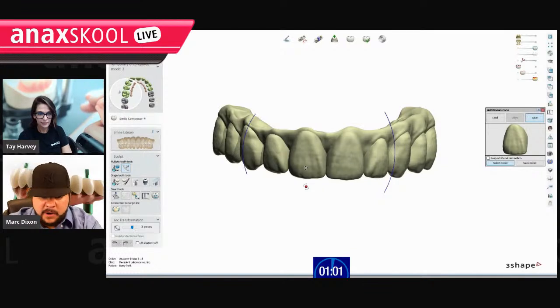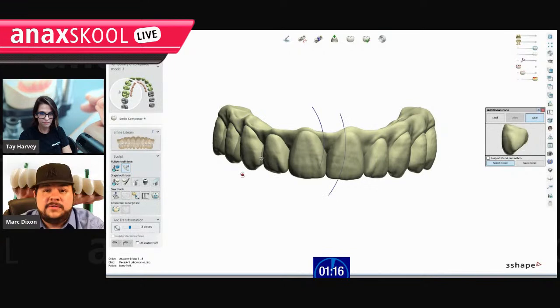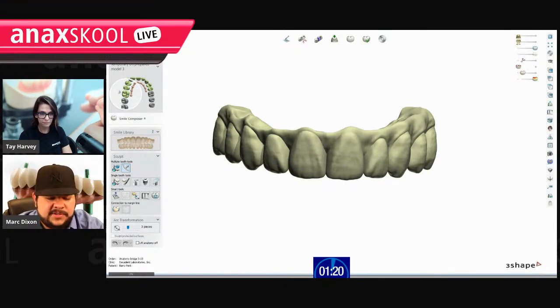But while you're designing, if you think you're going to have a problem, like you hit next and everything's starting to crash, you can go back one and use this new tool to save at least some of it, little bits and bits. But anyway, let's move forward and hit next. We're just going to get to the finalized stage where it's all one piece.